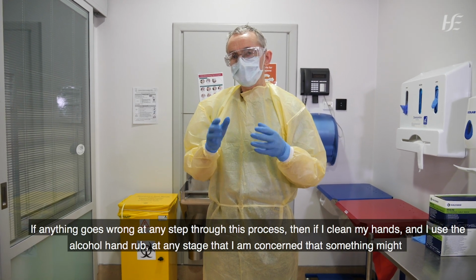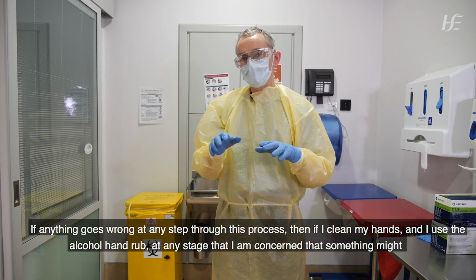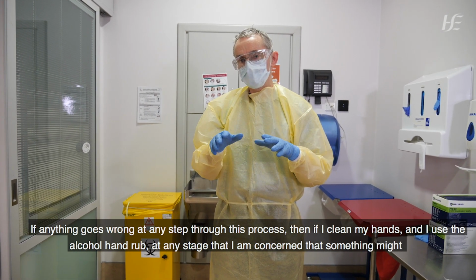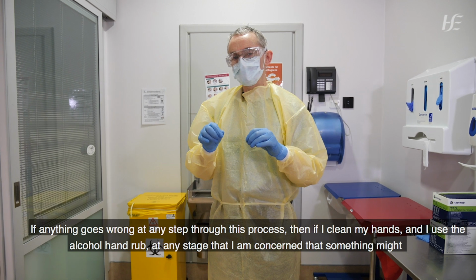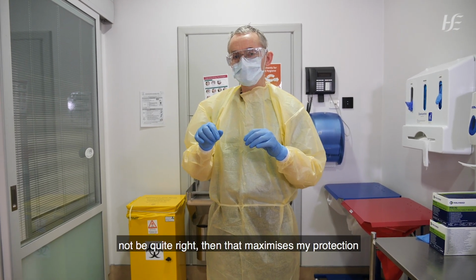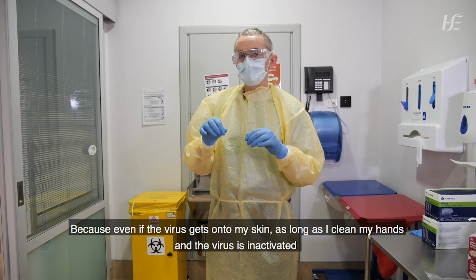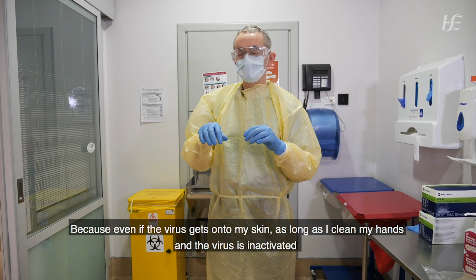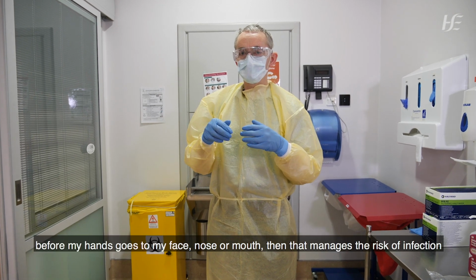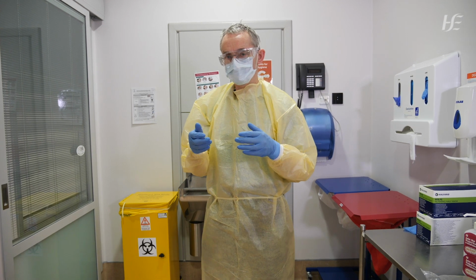So if anything goes wrong at any step through this process, then if I clean my hands, I'll use the alcohol hand rub, at any stage that I'm concerned that something might not be quite right, then that maximizes my protection. Because even if the virus gets onto my skin, as long as I clean my hands and the virus is inactivated before my hands go to my face, nose or mouth, then that manages the risk of infection.